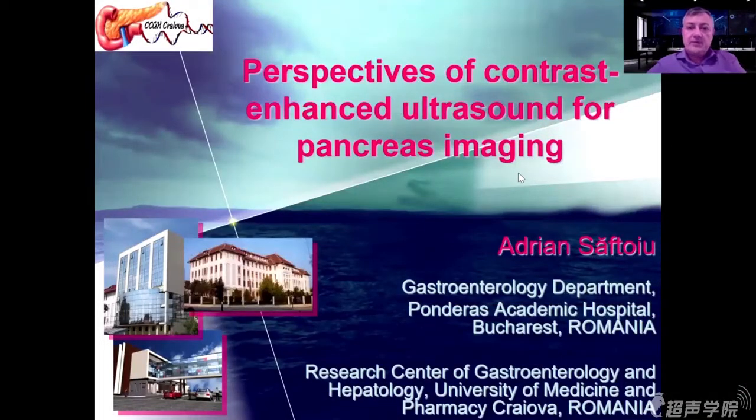Good day. It's a great pleasure and honor for me to present this paper on contrast-enhanced ultrasound for pancreas imaging.